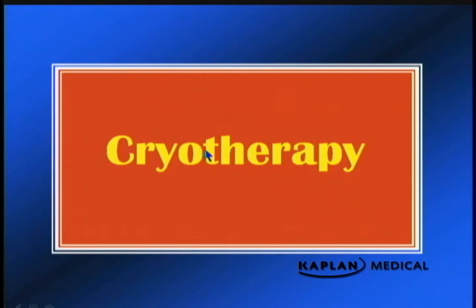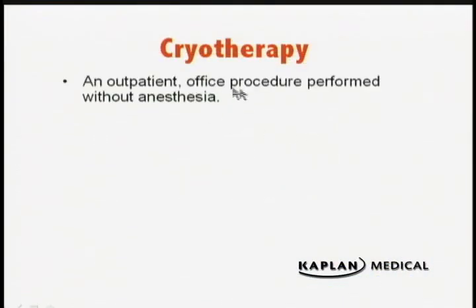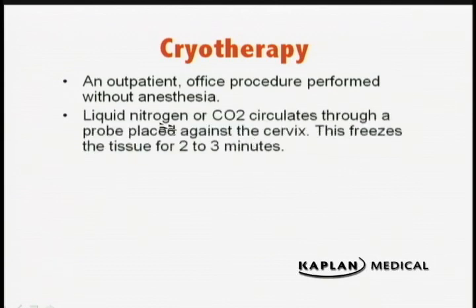Cryotherapy. Cryo means cold, and we are going to freeze the cervix. It's an outpatient office procedure performed without anesthesia. It is similar in that respect to the LEEP. Liquid nitrogen or carbon dioxide circulates through the probe placed against the cervix.